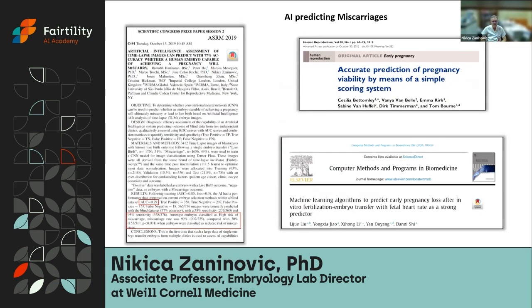There are even some efforts to look through the image of the embryos and predict miscarriages. This needs to be verified, but it's very promising. I think that's going to give us a fantastic view of which embryos to transfer or not, or even give us some ideas of which embryos to biopsy and do PGT on or not.